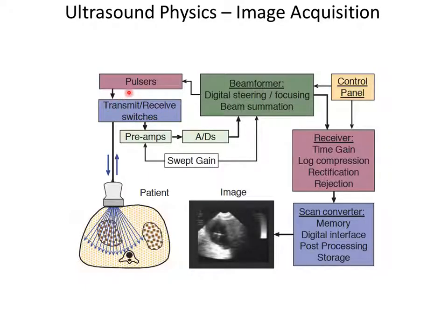And then basically you transmit here, and when it's in receive mode, the signal goes through preamps, goes through A to Ds, gets back to the logic of the beam formation so that the inverse can be done on the listening signal, right? So basically I've made a beam this way, and now I hear something back down from the source, so I can put that logic in reverse.